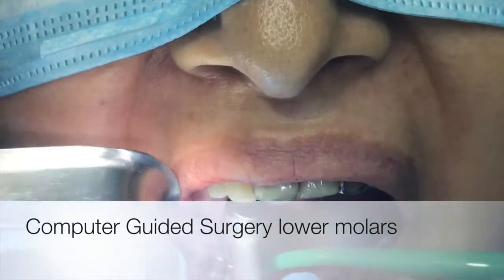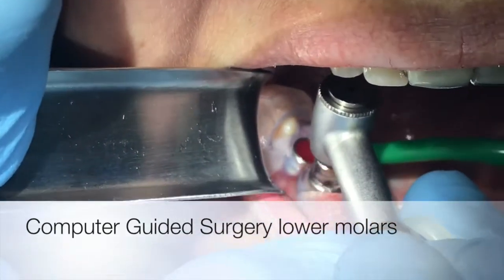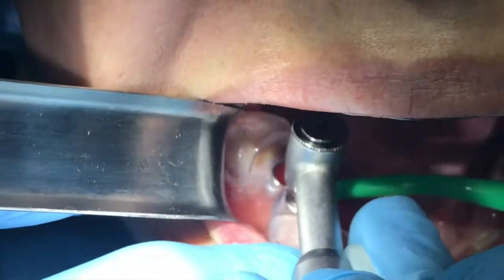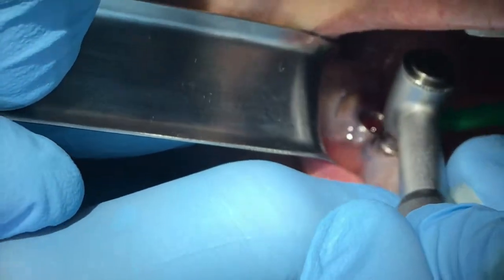We are going to introduce computer guided surgeries on lower molars. We are using the keyless system from Blue Sky Bio. What we see here is a system where we are lacking keys and we go directly to the surgical guide with stoppers.